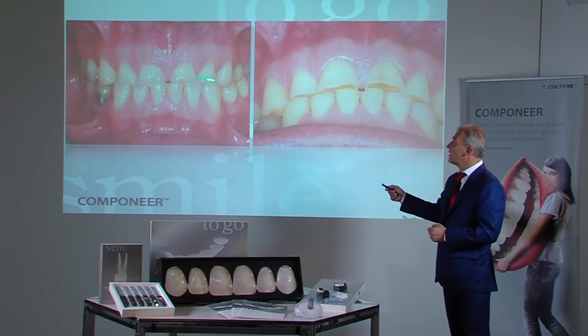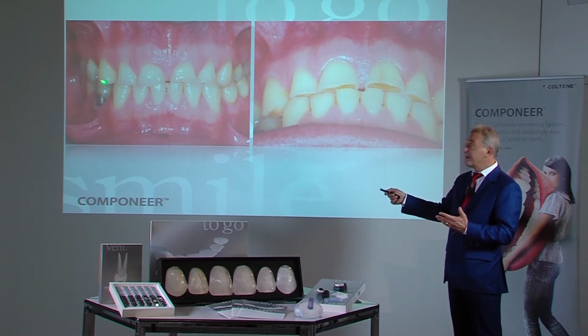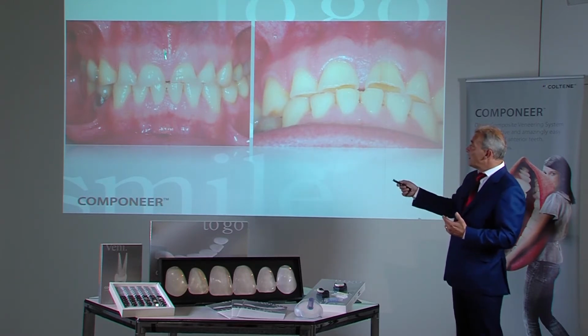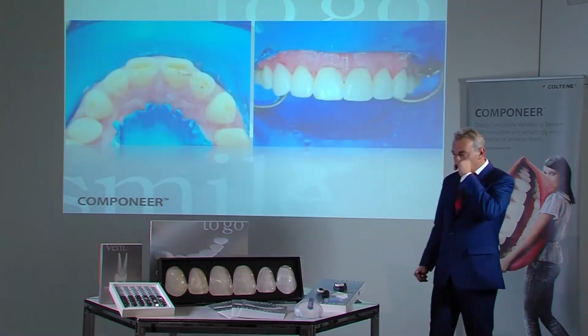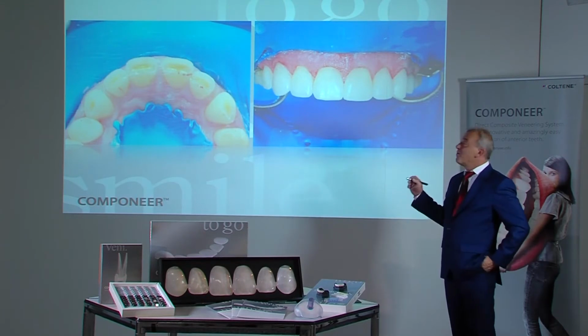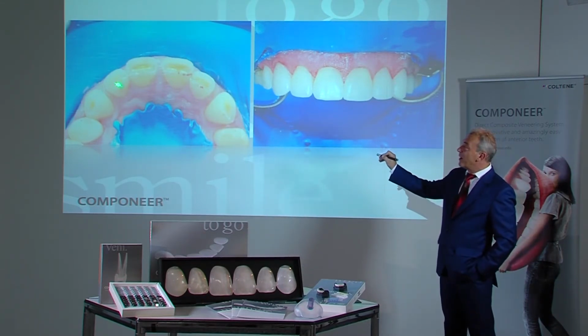Normally one would say, I need room, I need to perform bite elevation. But we had no vertical loss. The front is relatively steep. This is why one performs a palatal taper to create space as recommended in the first chapter, Preparation.